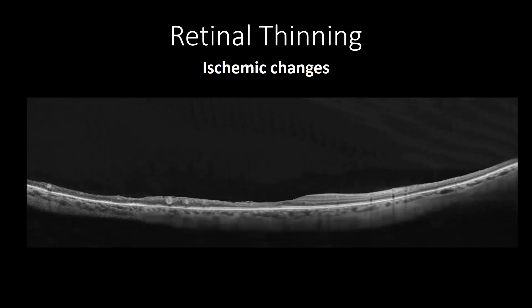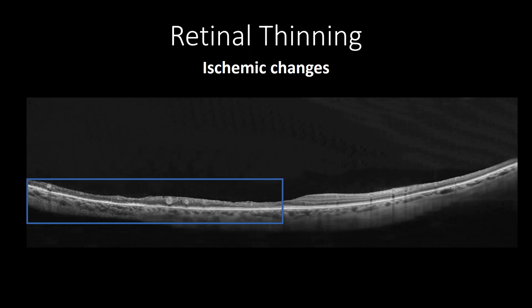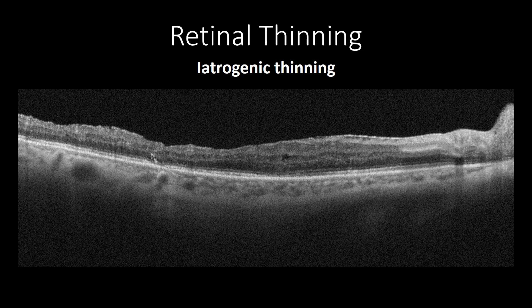Thinning of the retina commonly occurs due to ischemic changes, as shown in this vertical wide-field OCT cross-section of ischemic branch retinal vein occlusion, showing homogeneous contour thinning in the inner retinal tissue in areas of retinal ischemia, along with large hyperreflective dots representing the occluded vessels. In contrast, retinal contour thinning can be irregular, as this cross-sectional OCT shows irregular focal iatrogenic thinning of inner retinal tissue during pars plana vitrectomy.